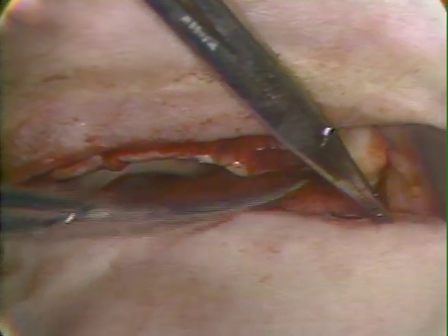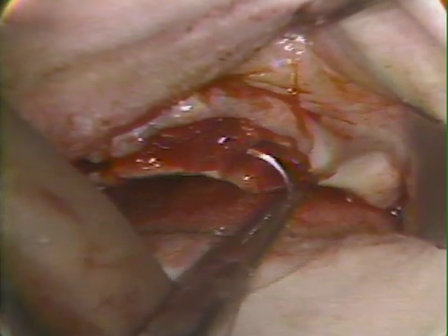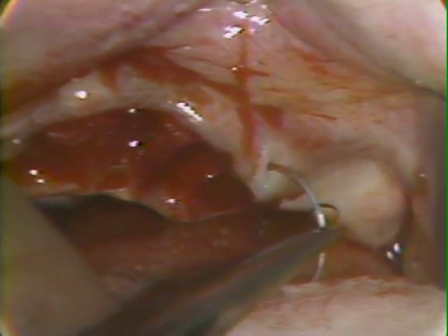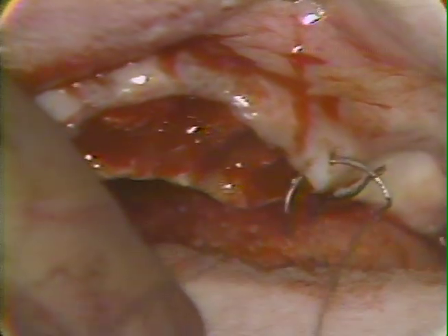And we'll use the continuous locked type of closure as we did in the anterior region down below. So when we get this triple tied, I will cut just the short end of it here, and with a needle I'll continue to make these interlocking loops of continuous locked suture. We're going here to the first point of bone bridge, and I'm going perpendicular so I go through the full thickness of the periosteal flap.